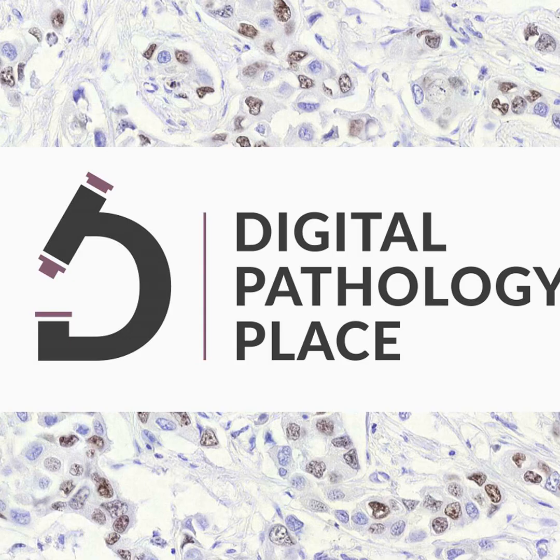So, okay, we know those three biggest pitfalls. What else? Are we good to go, or is there anything else? The next one that comes to mind is not thinking ahead towards validation. Sure, it's great if you understand your data, you've trained some model, but how are you going to know whether it's a good model? The first thing in the machine learning world is that you need to be sure your data, even your training set, you want to split it into different subsets. We typically call it the training, the validation, and the test set.